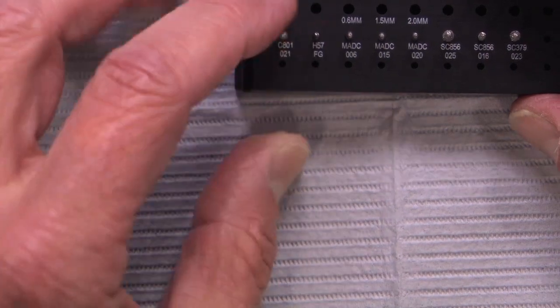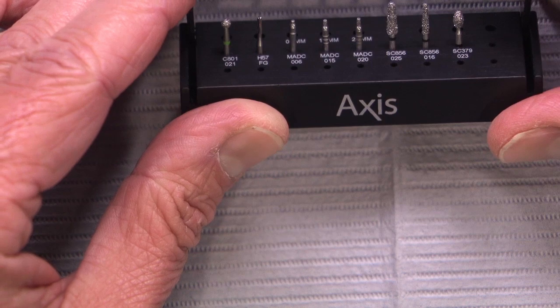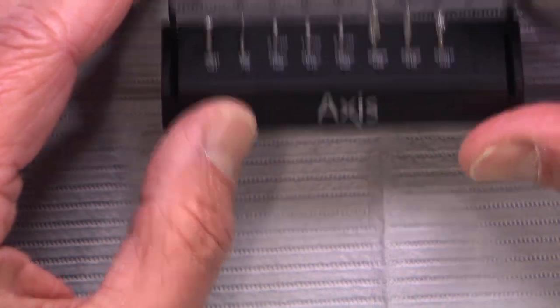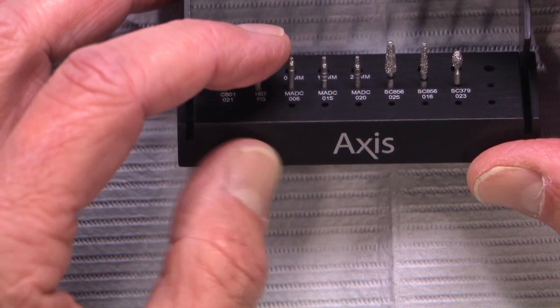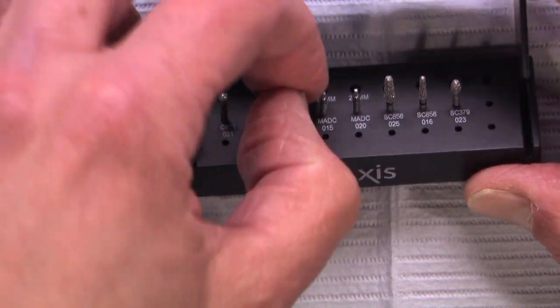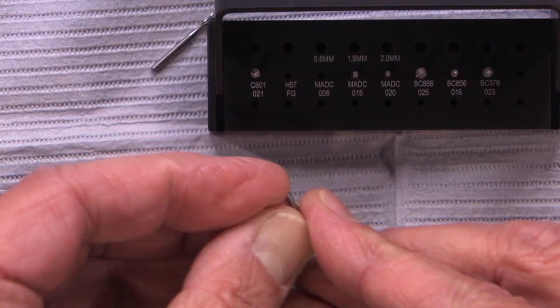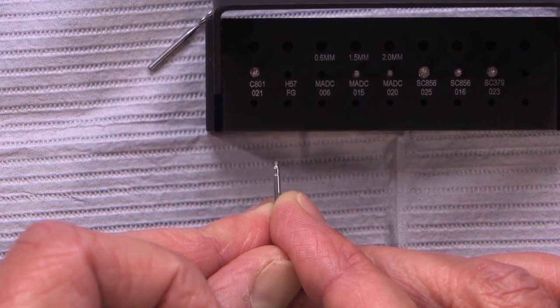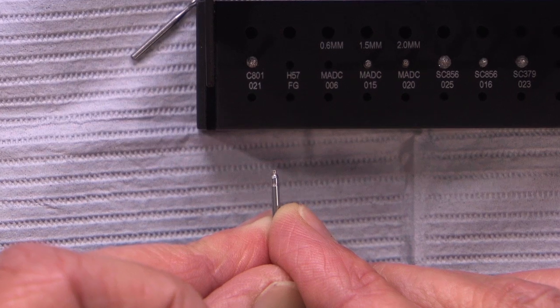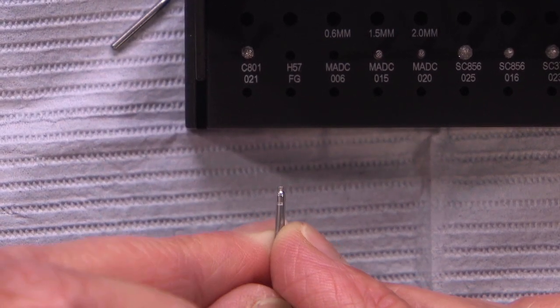The next thing we have are the depth cutters, and I got into these very early because when I first started working here, I was still under preparing teeth, and the technicians just would not stand for that. And so we have three depth cutters here. The first one is a 0.6 millimeter depth cutter. So there's one, you see that one ring on there, and it's a 006 on the burr kit. So that's a 0.6 millimeter depth cutter. That's the minimal thickness for Bruxer.